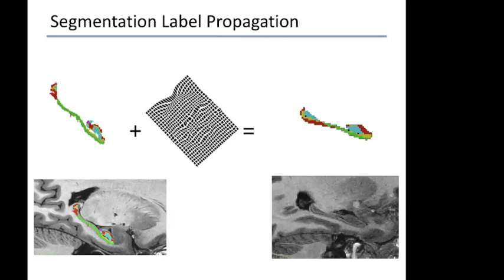You're trying to recapitulate some version of the gyral anatomy, the functional anatomy, the myeloarchitectonics, whatever. But you can also do it atheoretically, right? So dropping 1,000 equally spaced or equally sized parcels on the brain is also a parcellation. So in the ideal situation, anything you find in one of your connectivity analyses would be reproducible across parcellation schemes. I'm not sure if that answers your question.